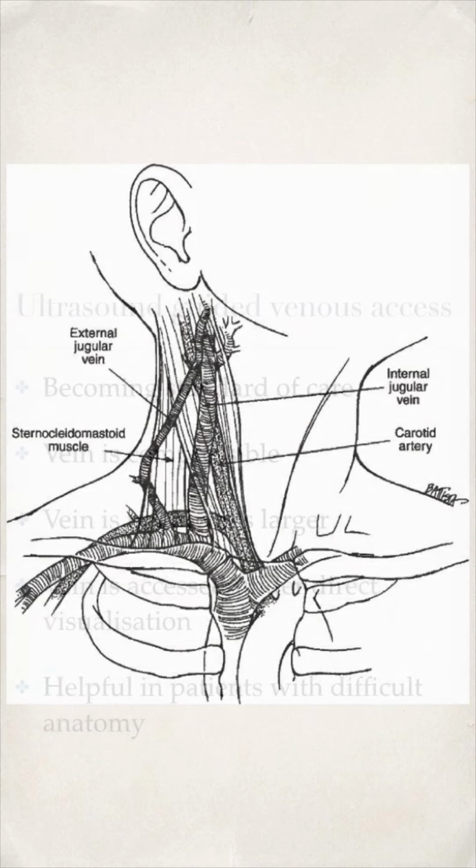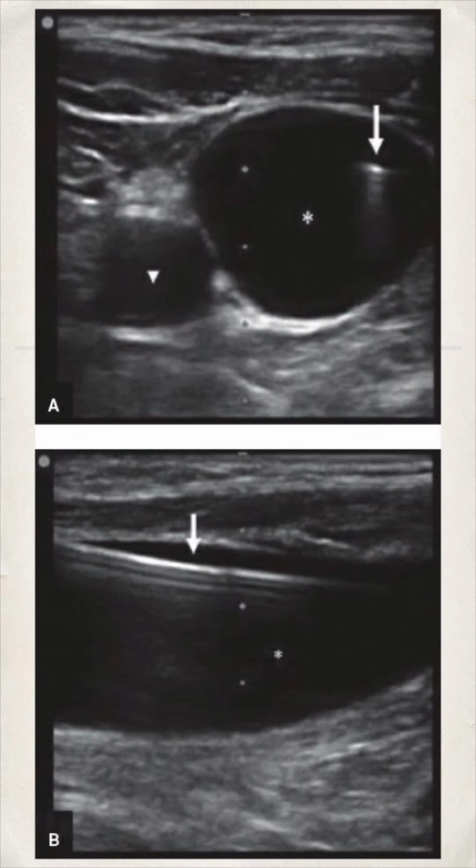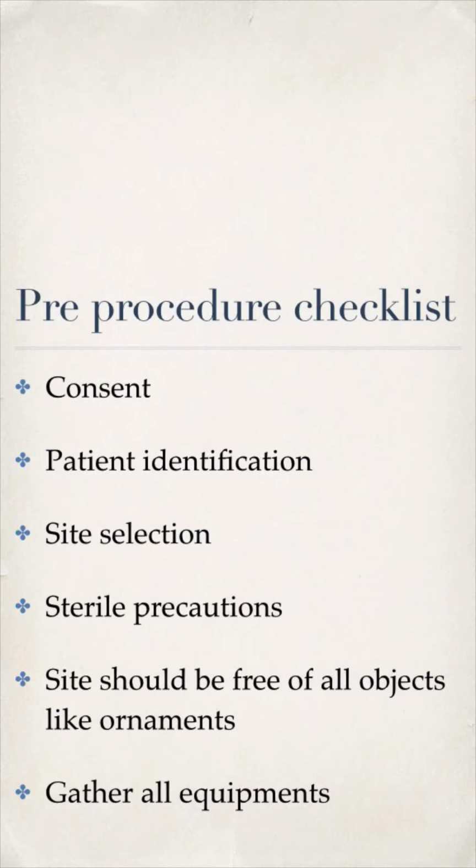So I'll be using USG, which has become the standard of care, and you will be expecting a view like this, the guide wire inside the vein and not the artery. I have explained the procedure to the patient, taken his consent, and of course prepped everything.